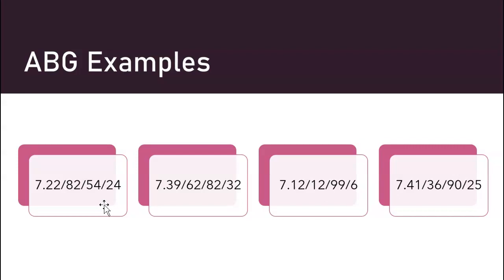This patient would need respiratory intervention. Most likely, per the NBRC, they would say intubation and ventilation, or else per clinical judgment, you could even consider non-invasive ventilation depending on what's going on. I literally just made these ABGs up, so yeah. That's that blood gas. Moving on to the next one.